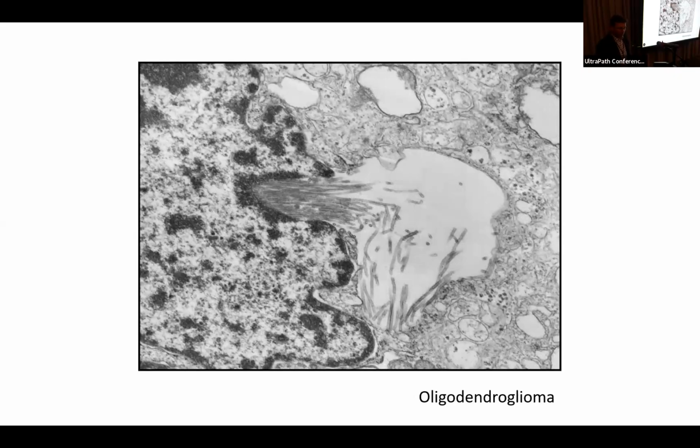But one place where they could be important is with an oligodendroglioma, which, when present, these cytoplasmic tubules that you can see can kind of make easy work of that diagnosis. That's a unique feature for these tumors. But this next kind of series of images shows how some of these pseudo-inclusions can be formed.